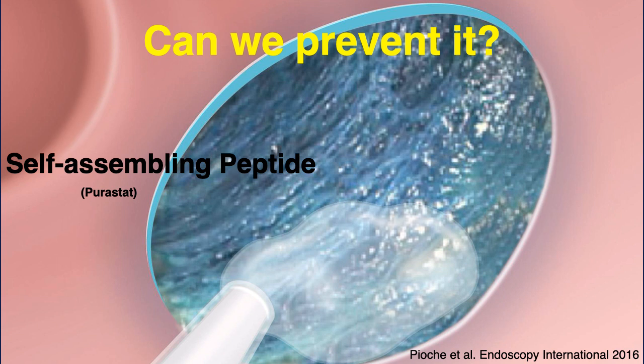And something we need to watch for. Say, for example, you do a nice resection, close the defect, go home, everybody is happy, but some of them come back with delayed bleeding. What to do? So how do we manage delayed bleeding?